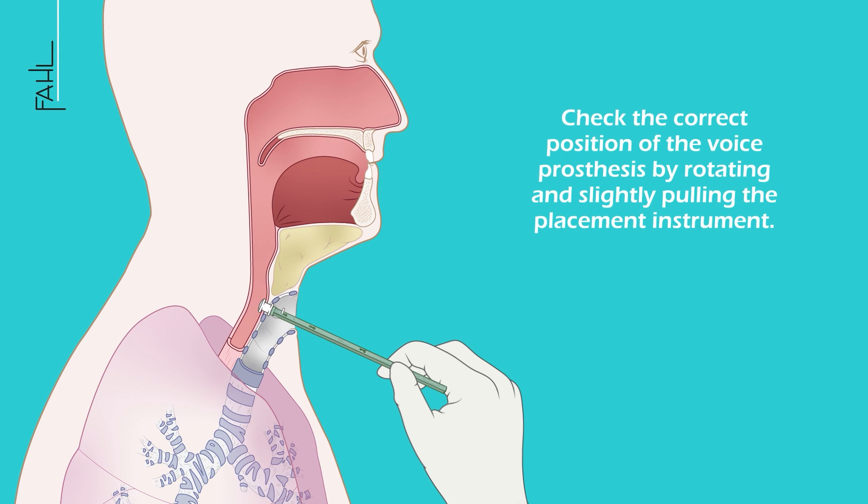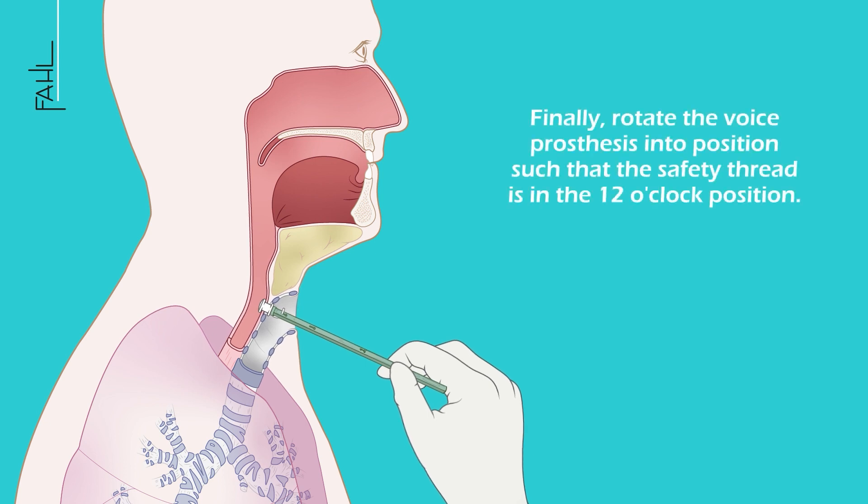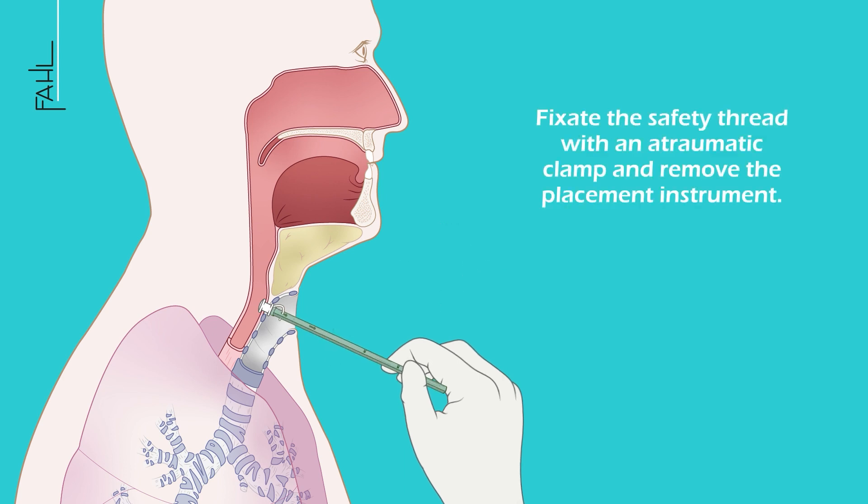Check the correct position of the voice prosthesis by rotating and slightly pulling the placement instrument. Finally, place the voice prosthesis into position such that the safety thread is in the 12 o'clock position. Fixate the safety thread with an atraumatic clamp and remove the placement instrument.